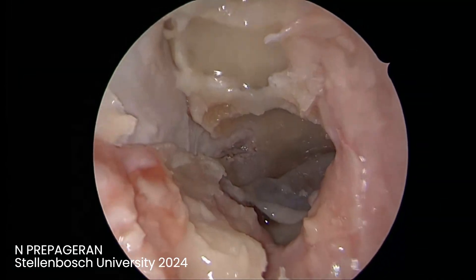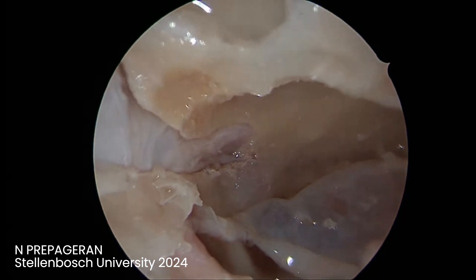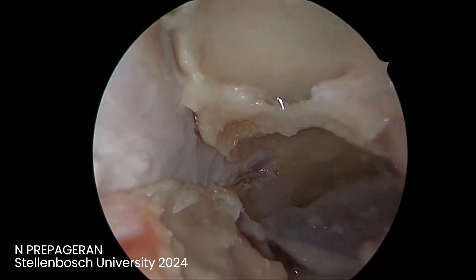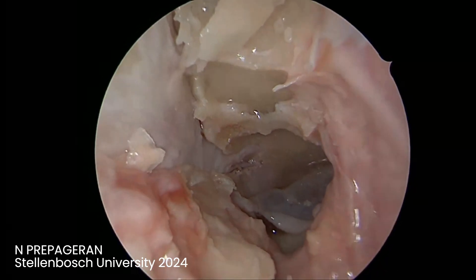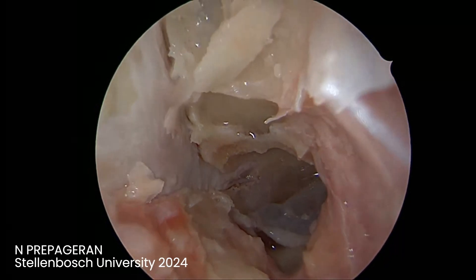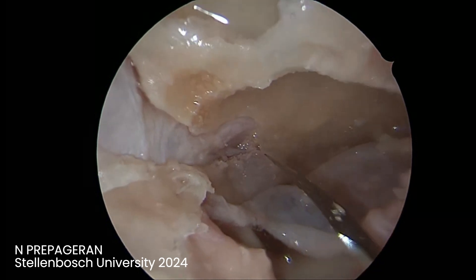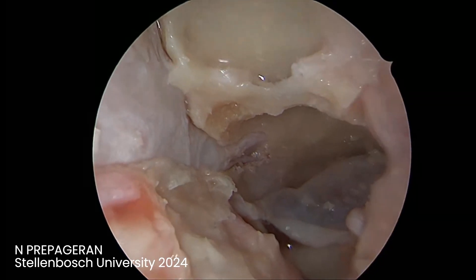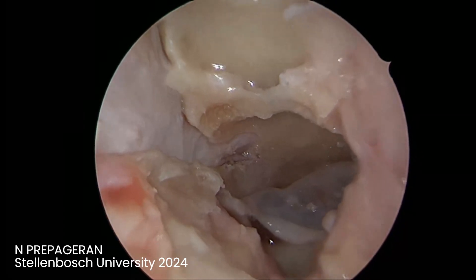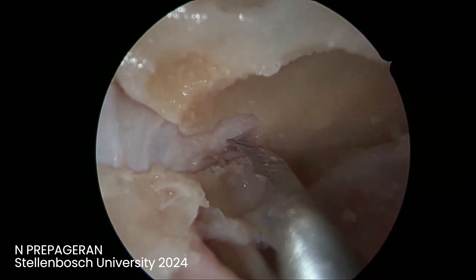That's the optic nerve decompressed, all the way to the opticocarotid recess. So if you need to do an optic nerve decompression: if your compression is from the outside, removing the lesion is enough. But if you have optic neuritis where there's a lot of edema inside the nerve, then you need to cut the perineural sheath.